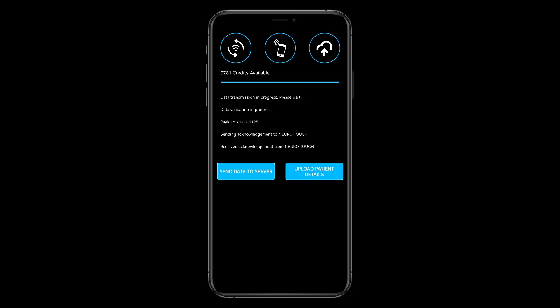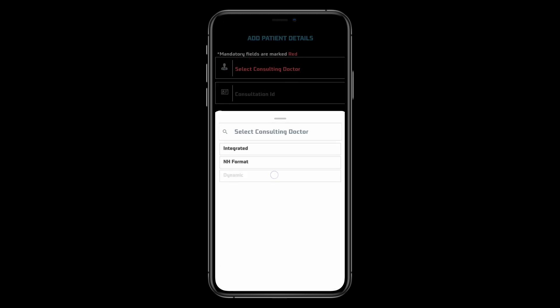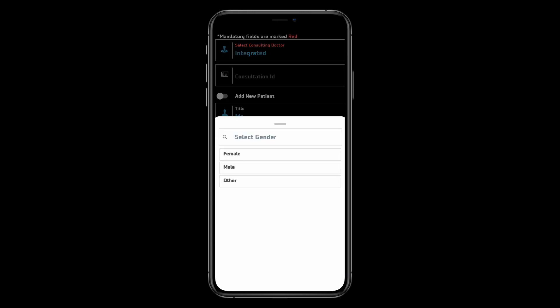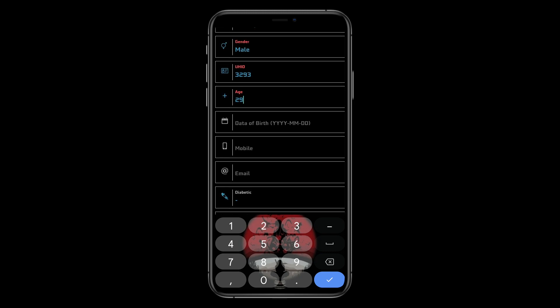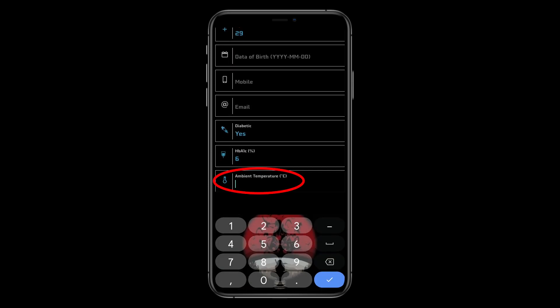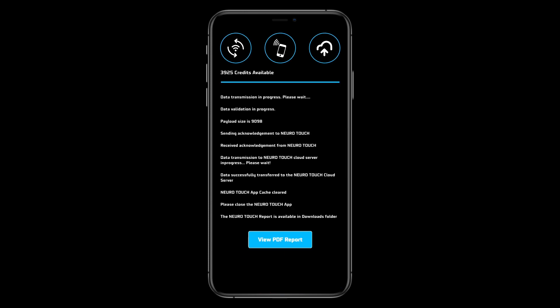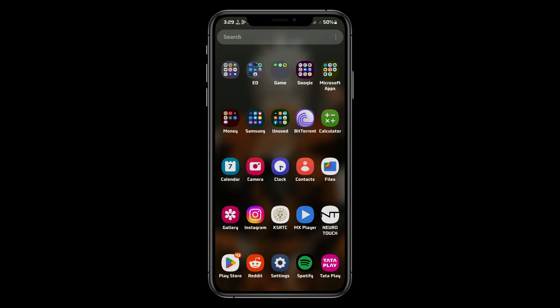There will be two options: Send data to the server, or upload the patient's details. Select the consulting doctor and fill in the mandatory details. Fill in the ambient temperature without fail. You can view the report within the app and also in the file manager.